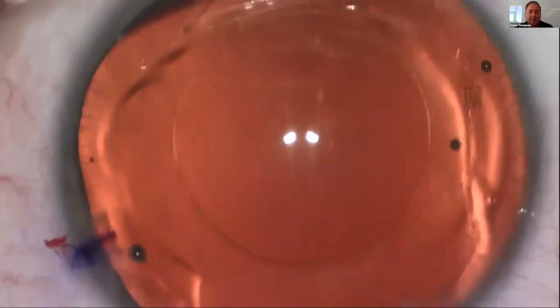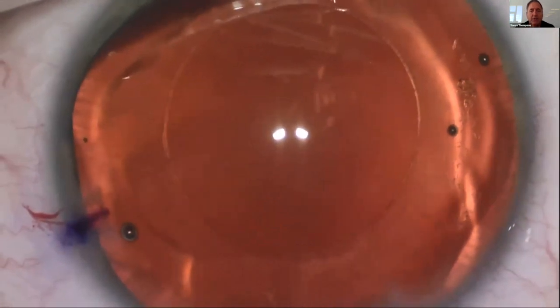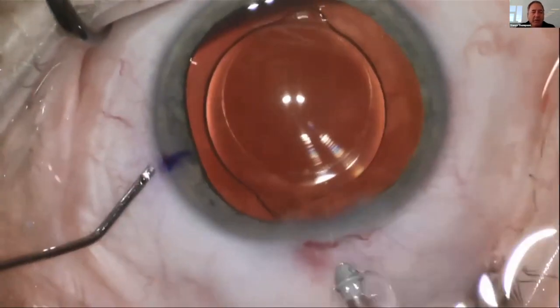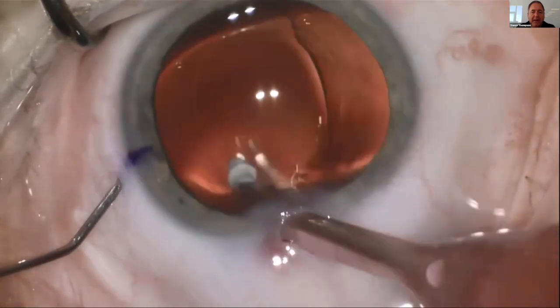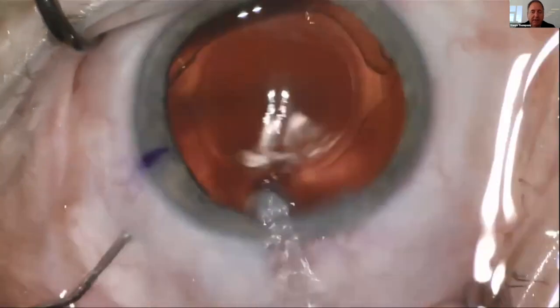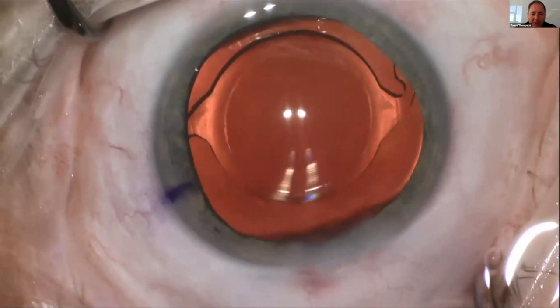I have a nice capsulotomy. Because I know my capsulotomy is centered nicely on the patient's visual axis, I can use it to guide my implant centration. When I place a multifocal implant and I know I don't have 360 degrees of overlap, I know there's a happier spot for that implant in the capsule, and I rotate until I get the capsule in a beautiful place with the implant. So I can use both the Purkinje images and the capsular edge for centration.